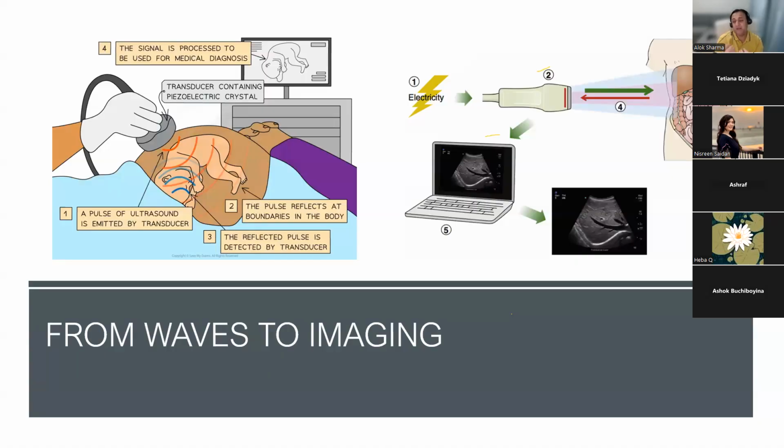They don't actually look at tissue reflection, like the liver looks like tissue. With the patterns we see, we generate A and B lines, and eventually it's the interpretation of A and B lines, as well as what I would call the C profile, which eventually gives us a diagnosis of this kind of six pathologies that we want to be confident at diagnosing by the end of this course.